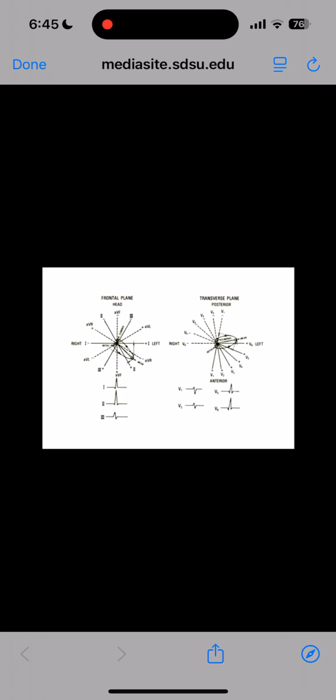Yes, every heart is in its own unique position. And this is one of the reasons why cardiologists will spend about 4 to 5 years of looking at normal ECGs to recognize what looks normal and to kind of very quickly know exactly this person's heart is this way, this person's heart this way, this one's like this, and all the little subtleties because everyone's heart is in its own unique position. Okay? And I will get to that in a few more moments as well.